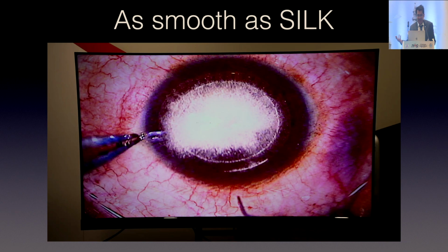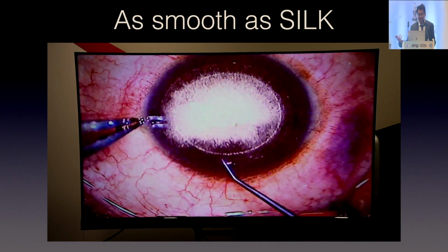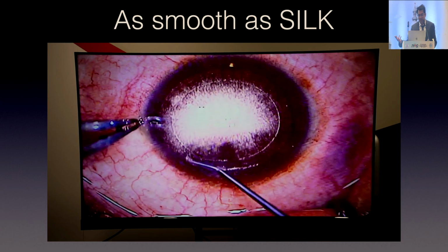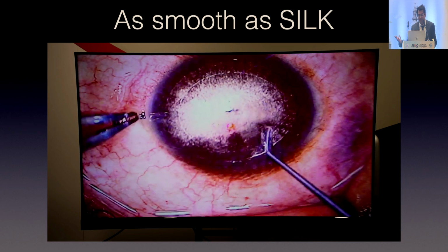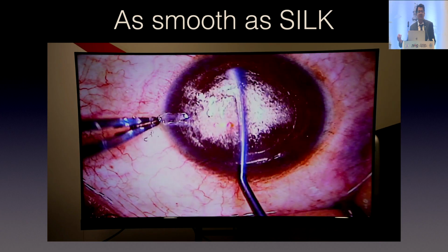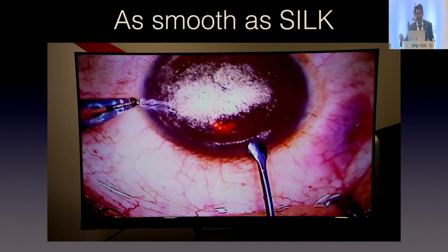Never seen before, such beautiful dissectionless extraction procedures. So just showing you one quick video. And why is it actually called SILK? So open up the anterior plane, open up the posterior plane, and then you don't have to put any effort. There is virtually no resistance. It is something like slipping your instrument in the interface and it's done.